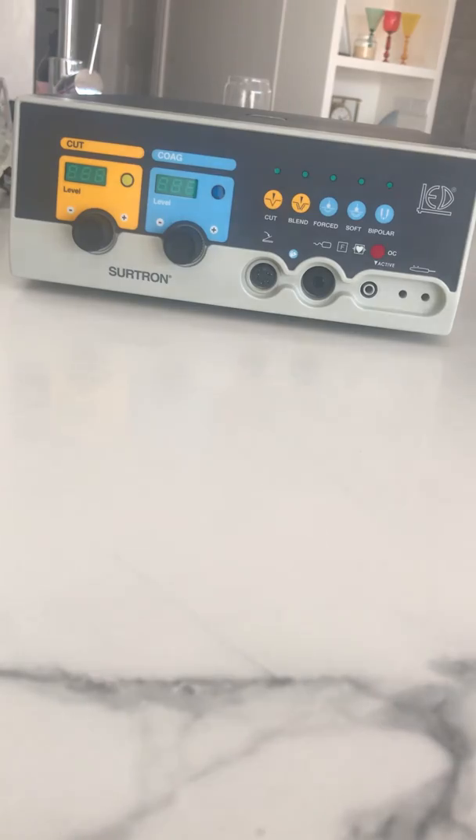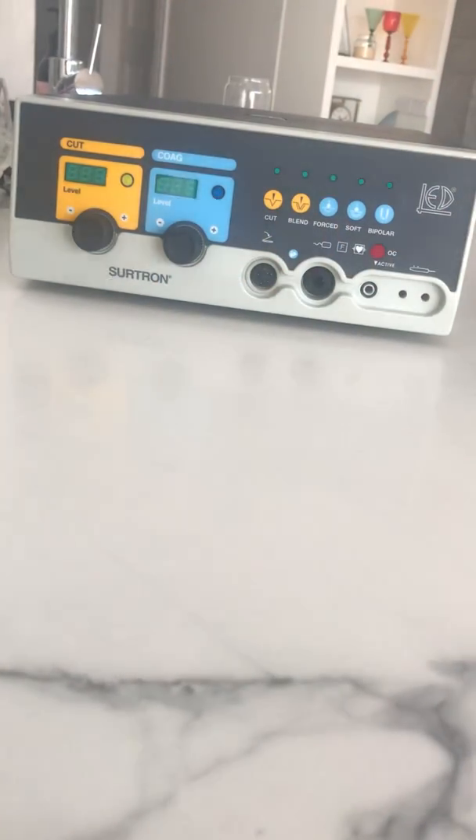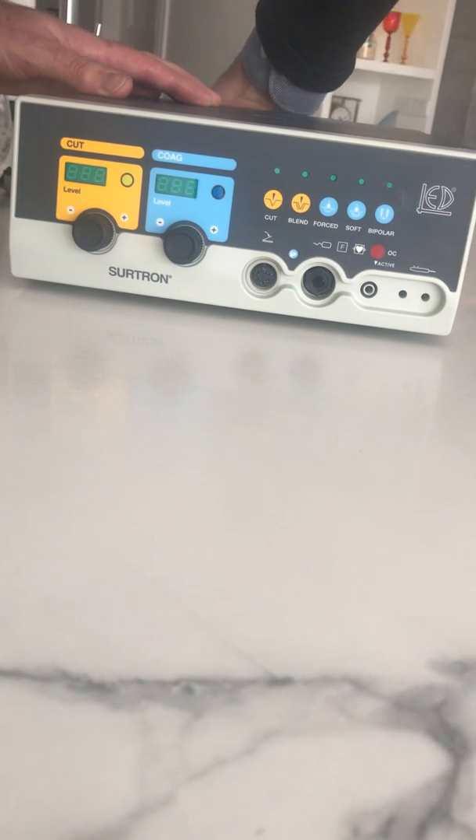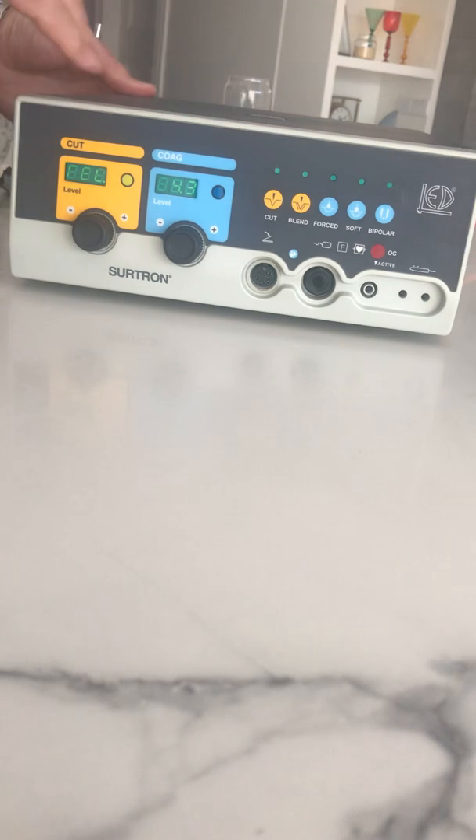You can see the unit there on the video. I've got the power plug here and I'm just going to plug that in at the back of the unit. We'll just turn that off in the meantime.